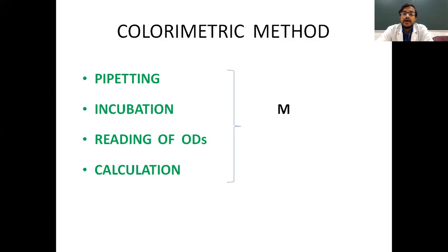I already told you, once a sample is given, it will take half an hour for calculating one sample. If 100 samples come to us, then it will take more than one week. So that's why we can't use this method in regular practice, because it will take a lot of time and a lot of manpower. That's why we went for the advanced versions, the auto analyzers.